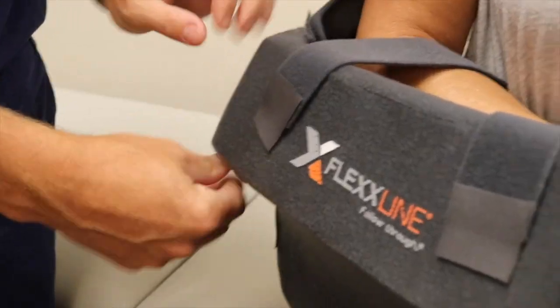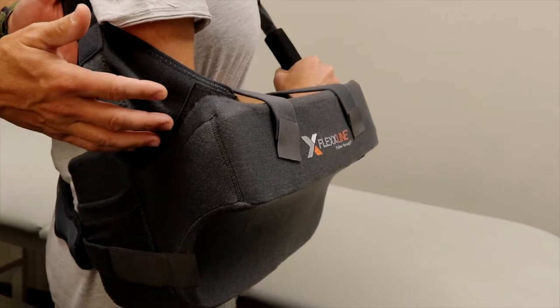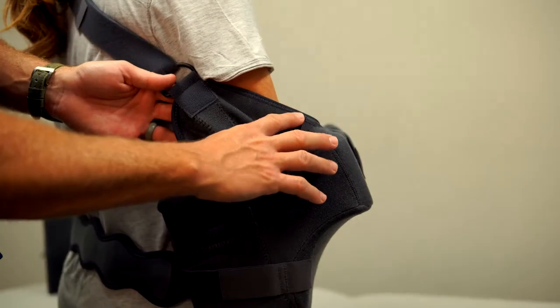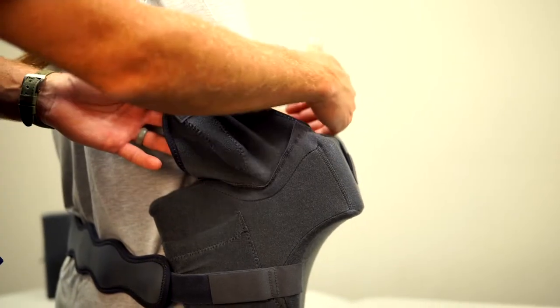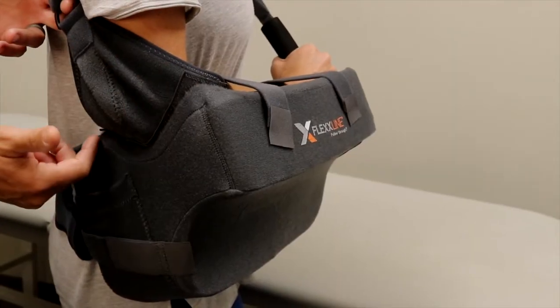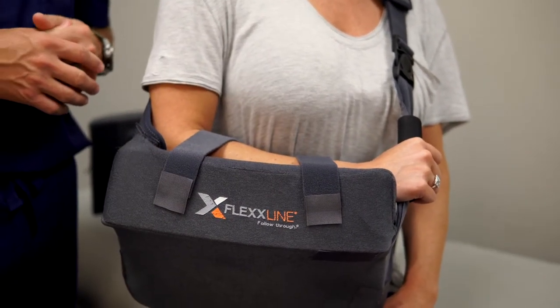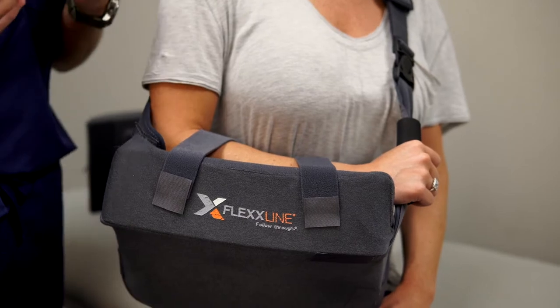The Shoulder Carrier has been designed with patience in mind. Flexline designed an elbow cup that can be moved more to the front or the back, which provides extra confidence through stability. You can also use the optional forearm cross straps for added security if needed.